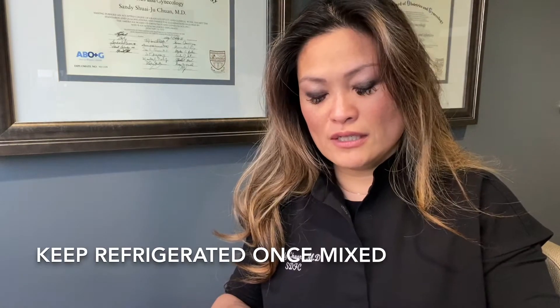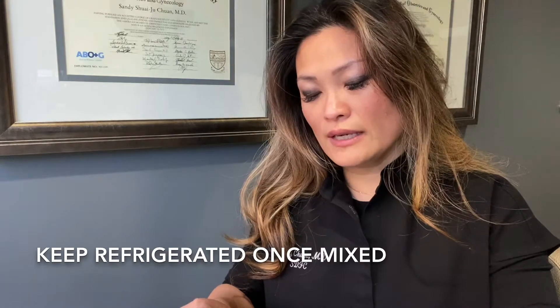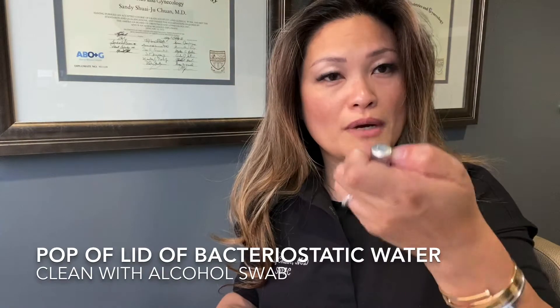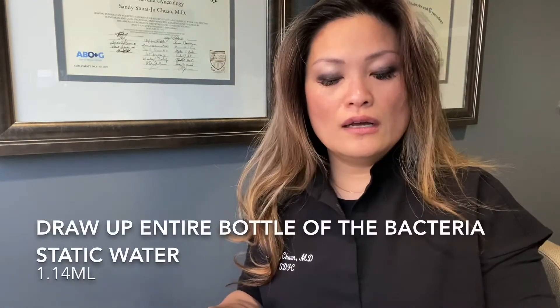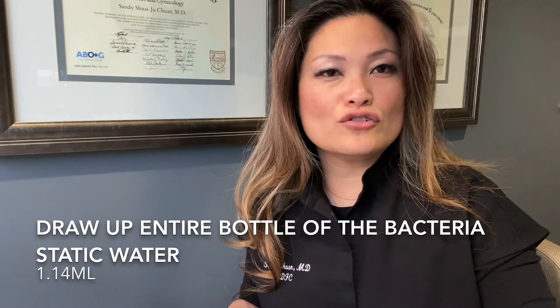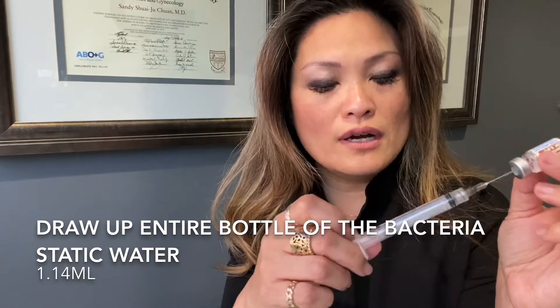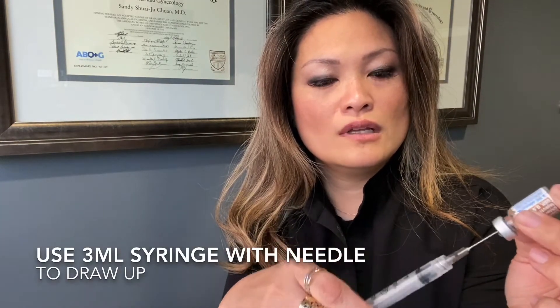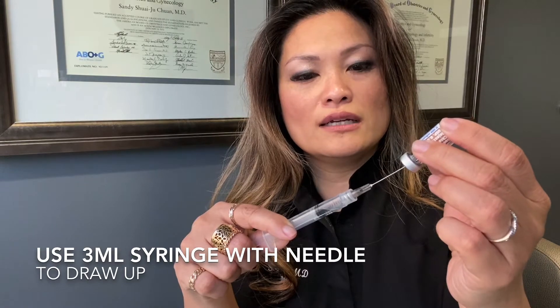For purposes of demonstration, I'm going to use this little bottle here that has saline in it, but you want to use the one that comes with your kit. Pop off the lid, clean it with an alcohol swab, and then draw out the whole thing. This has 1.14 ml of fluid — that extra little bit accounts for any loss. Take your 3 ml syringe with the big needle and draw up all the fluid, keeping your needle in the fluid and not in air.